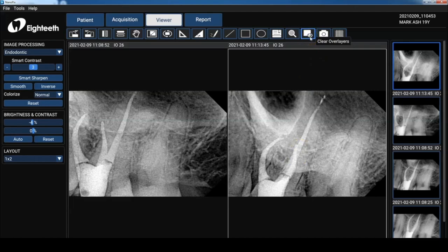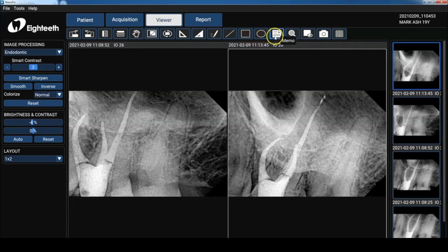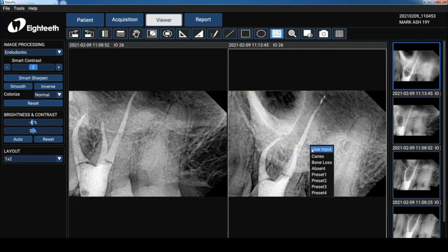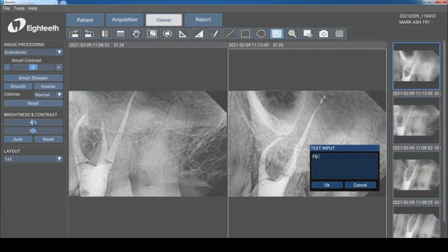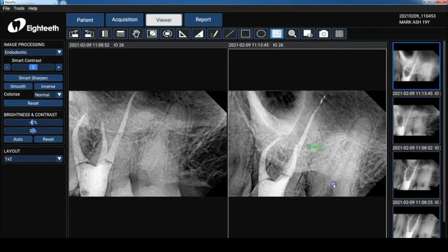You can place a rectangle, ellipse, drawing. And one of the other tools you can use is just placing notes. So place a memo onto the image just to place some notes. I'm going to put in, we're going to follow up in six months.